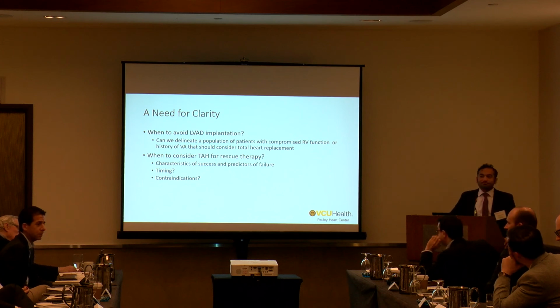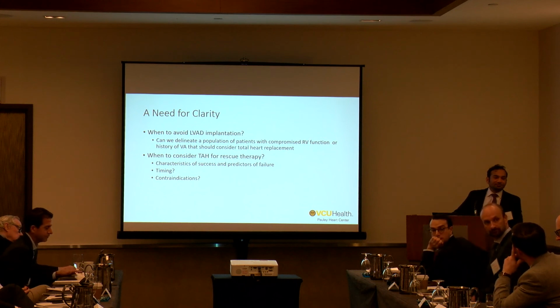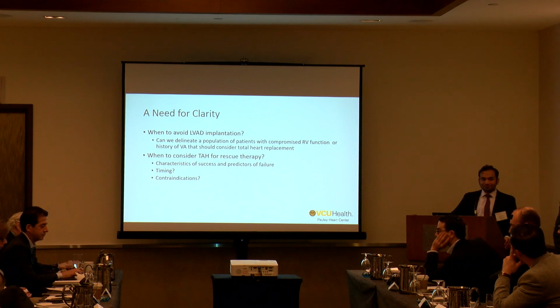But otherwise, yes. How long will you let your patient remain on ECMO before you decide to switch to TAH? Because at least in Canada, we have the possibility to have the emergency status for our ECMO patients. And one of the major discussions we have with our cardiology colleagues is, okay, let's wait another 24 hours and see if we have a donor. And finally, we end up after 10 days on ECMO, and okay, that's time, let's go to the TAH.